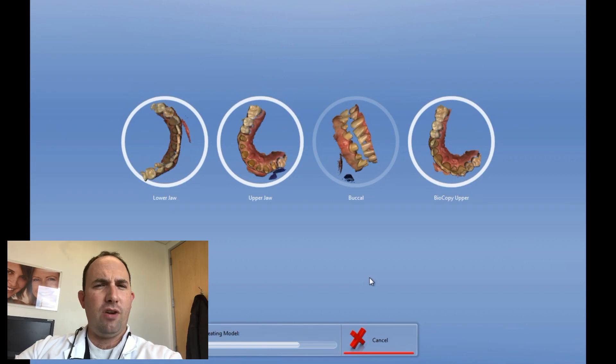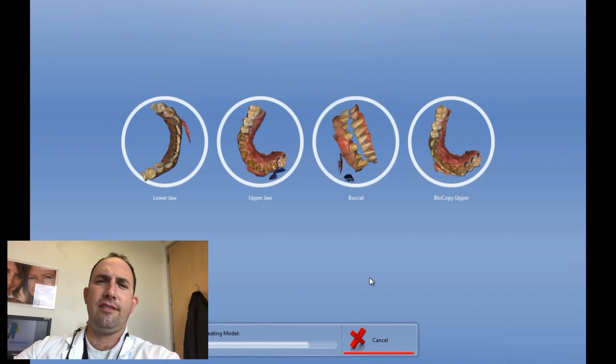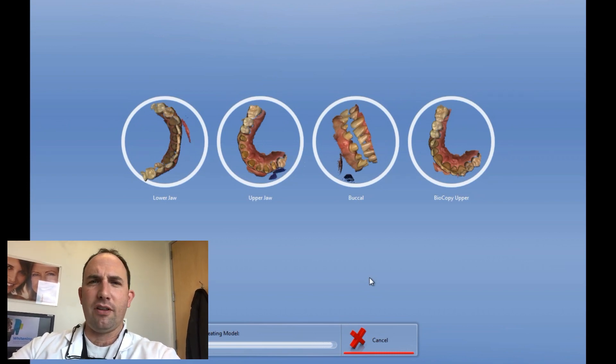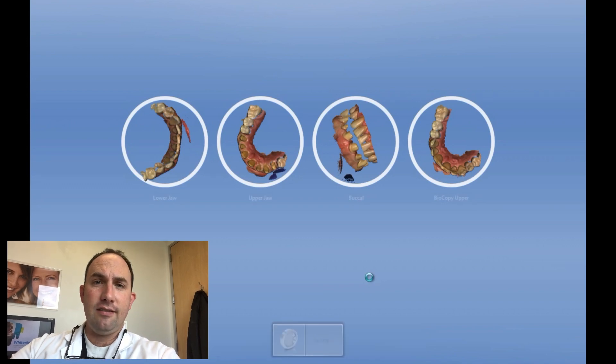So the preps are a little bit rough. After I imaged it, you always see your imperfections. Didn't yield any problems with the bonding though — everything went in perfectly. Nice case, challenging case.